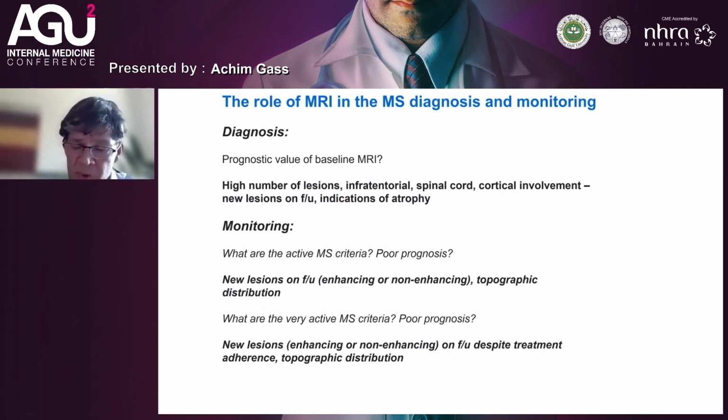But at the same time, you have prognostic information of what this patient looks like in terms of the future perspective. And that can be very helpful, particularly as the clinical information may vary from patient to patient. Some patients don't want to speak about symptoms, while others just do the opposite. And there you have at least the possibility to have some background information to get more information.